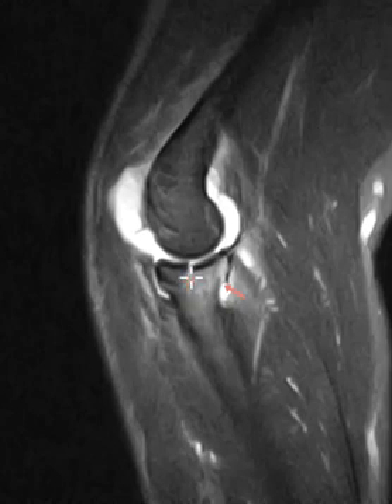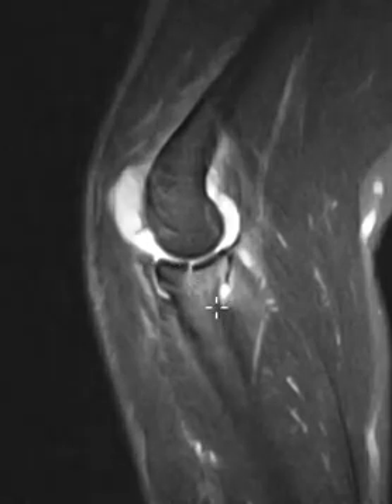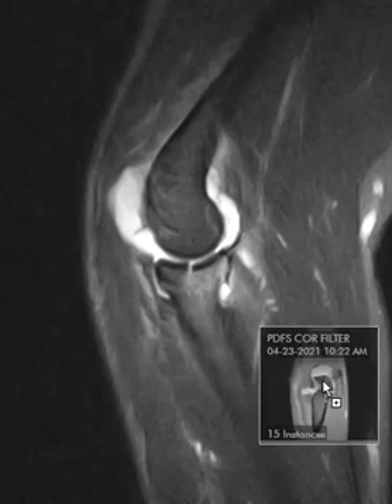We see one arrow pointing to a fracture right through the radial articular surface. The black line is the bony cortex, and there's that fracture, and it was just in a plane previously where we could not appreciate it — and that's why it was invisible.